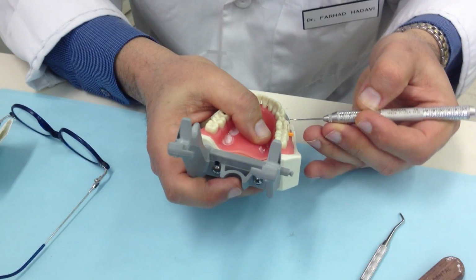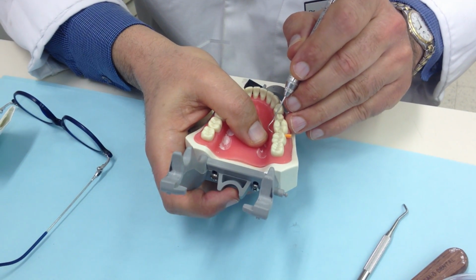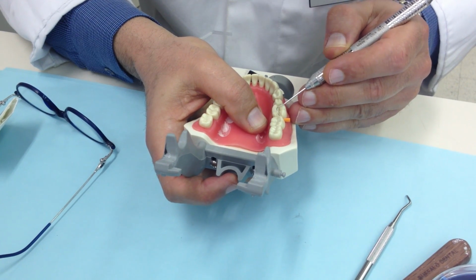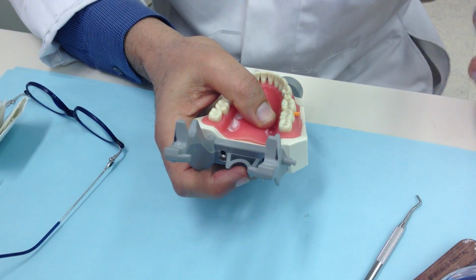Can you see that one? I have a nice seal all around this area, and the opening of the wedge comes right to my gingival cavosurface margin, correct? So I know that this is a very good wedge. So I remove that one.